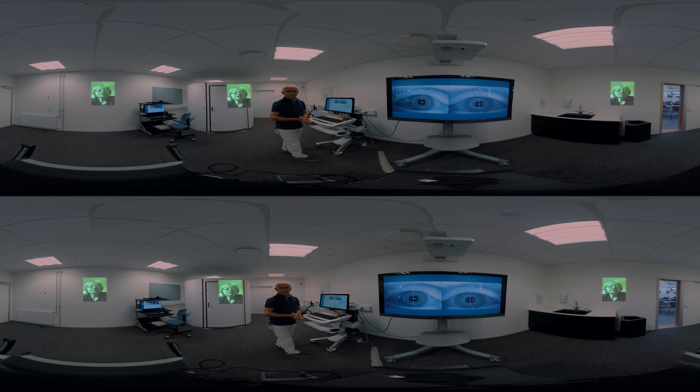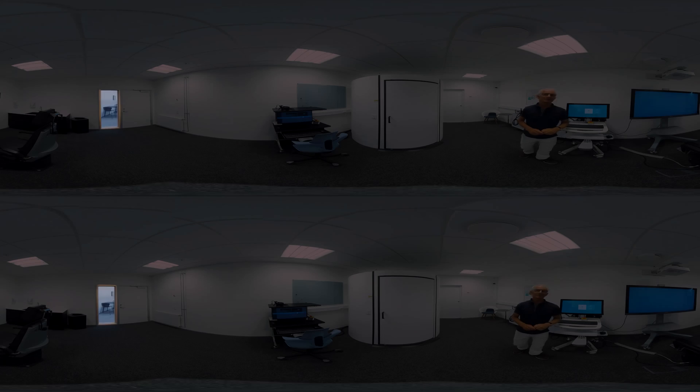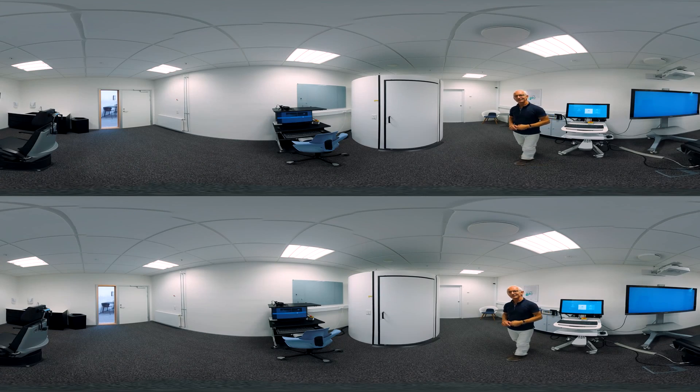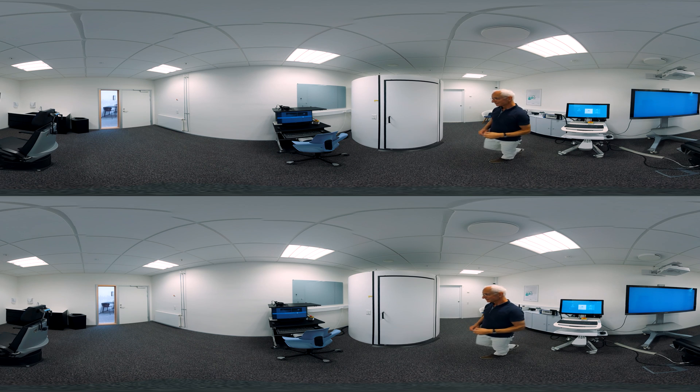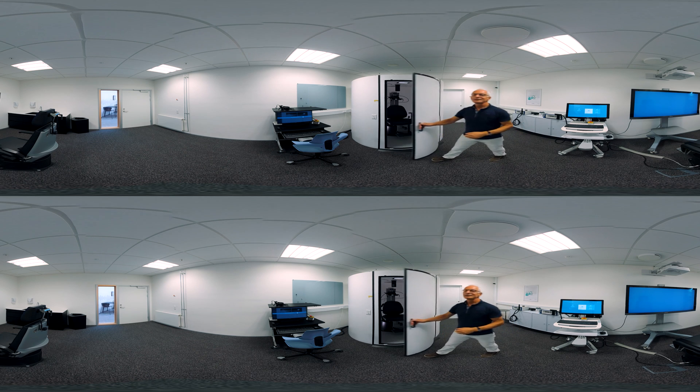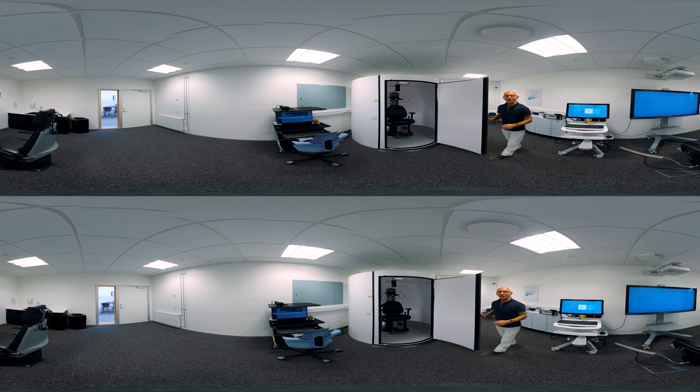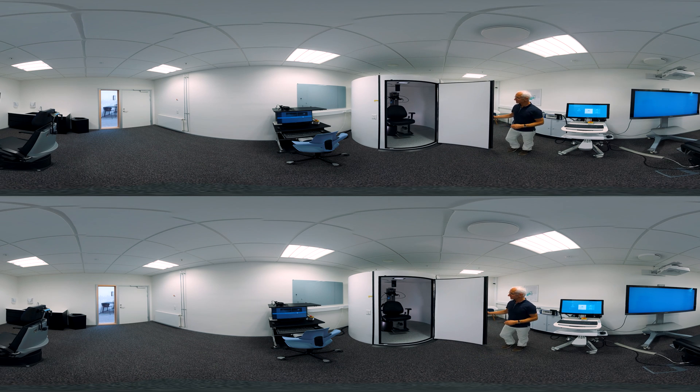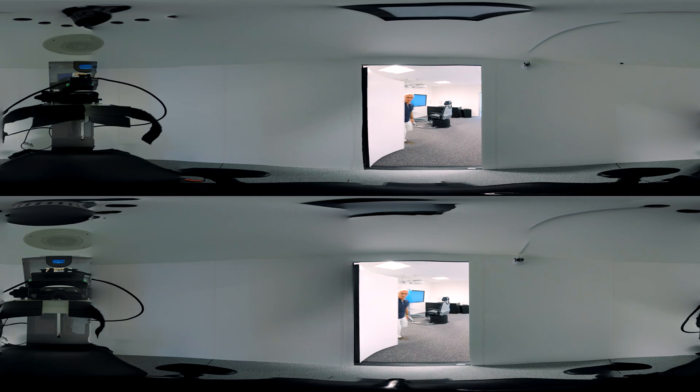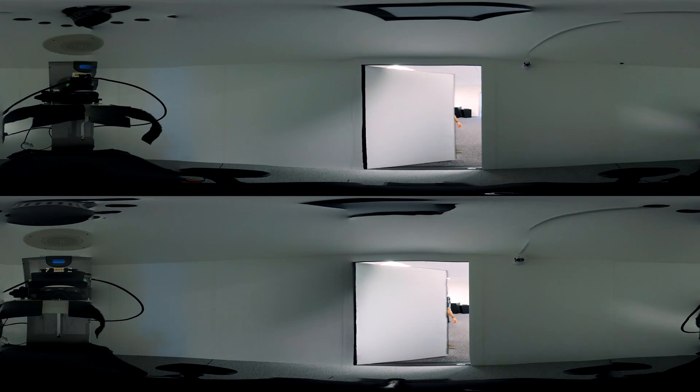There is one more thing we want to show you through the eyes of your patient. This is the Orion auto traverse chair. Step inside and we will show you one of our Visualize balance tests.